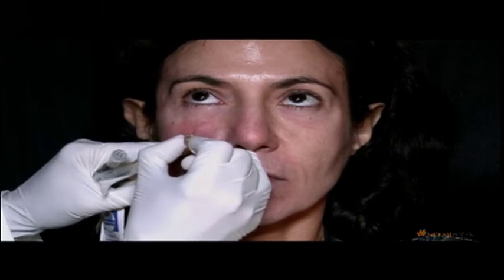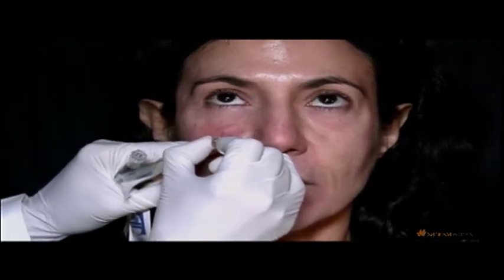Now, what do we need to be aware of here? The infraorbital foramen, mid-pupillary line, we can feel the little notch at the orbital rim. So I'm going to make my entry point outside of this area. And the entry point is going to be with a 26 gauge needle, and then I'll use a 27 gauge 1.5 inch needle, 38 millimeter, to actually do the injection. This is a blunt cannula that I'm going to be using.